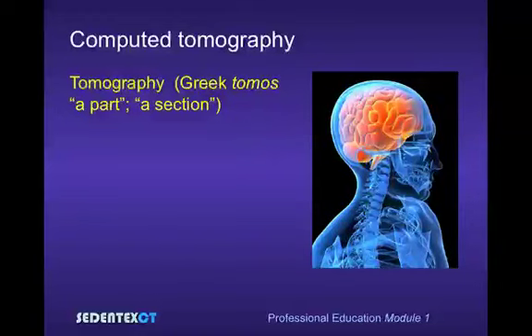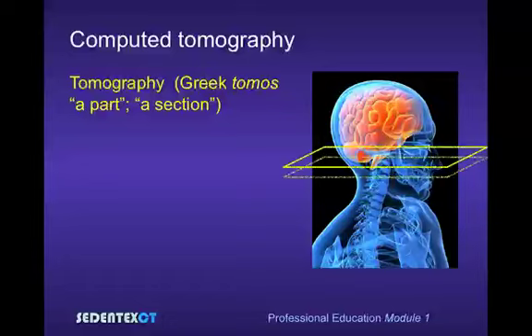Having dealt with the very basics of X-ray imaging, let's try and move a little closer to the subject of this module. But we'll start with the concept of computed tomography. The word tomography derives from the Greek word for a part or a section of a patient.